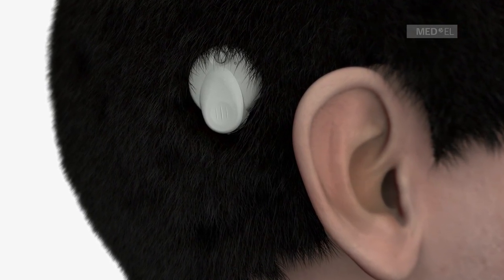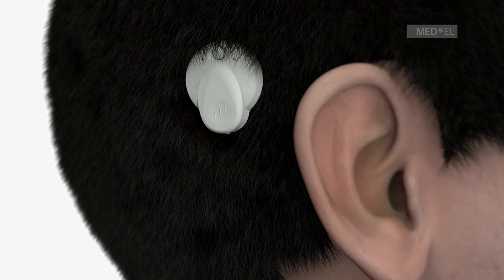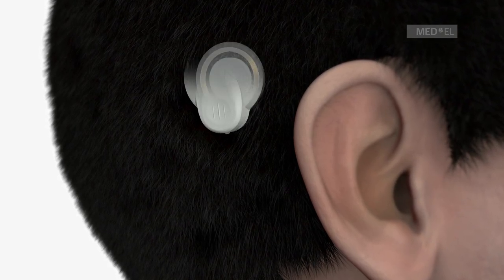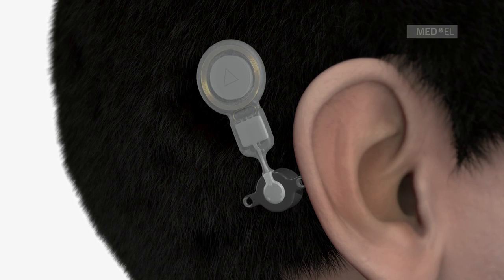The BoneBridge hearing implant system consists of an externally worn audio processor and an implant which is surgically positioned under the skin.